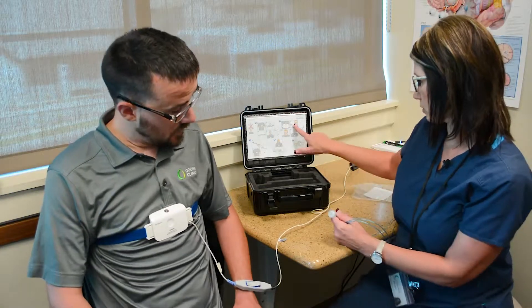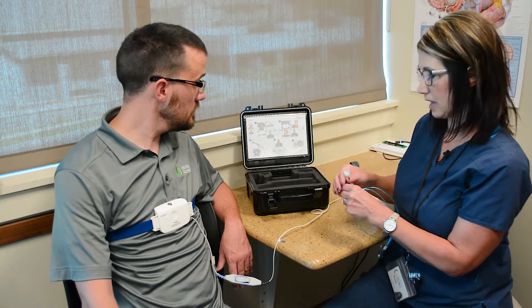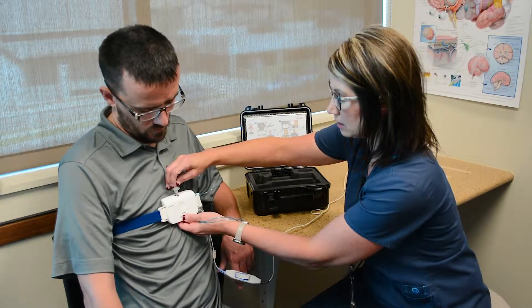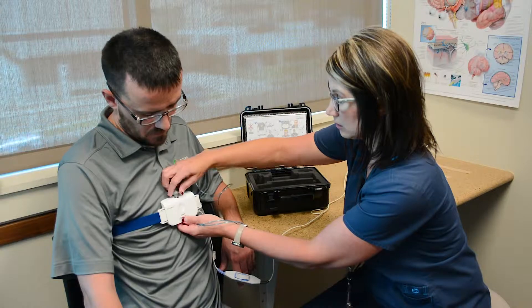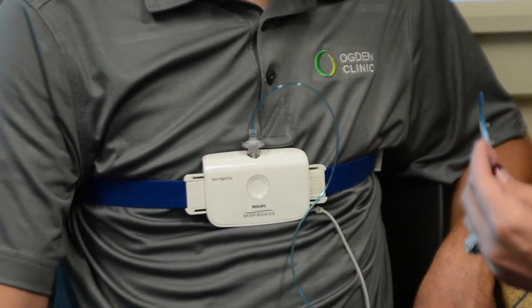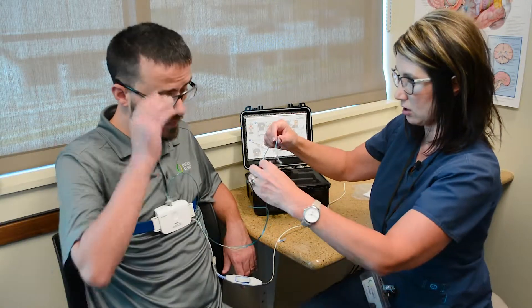The next thing we're going to do is monitor the air that comes in and out of your nose. In order to do that, we're going to use this cannula — it's going to fit right in here. It looks like oxygen, but it is just sensing the air that comes in and out of your nose.